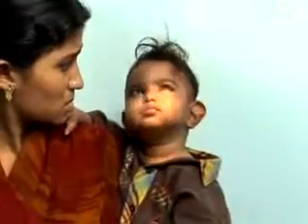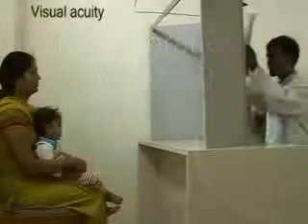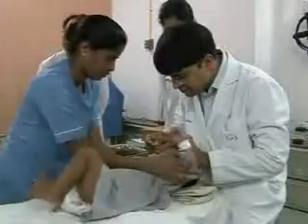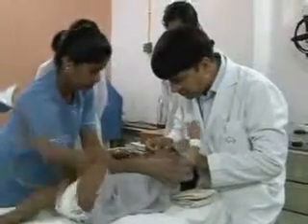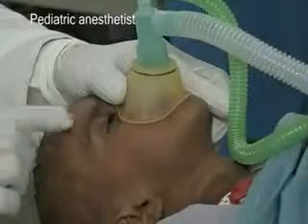If the infant is less than a month old, measure the current visual function by assessing the response to light. For an infant aged between 1 to 6 months, measure it by fixing and following light, and in older infants by checking the fixation to light. In older children, Teller acuity cards or preferential looking may be used. Examination may be carried out either by restraining the child or by using sedation or anesthesia.